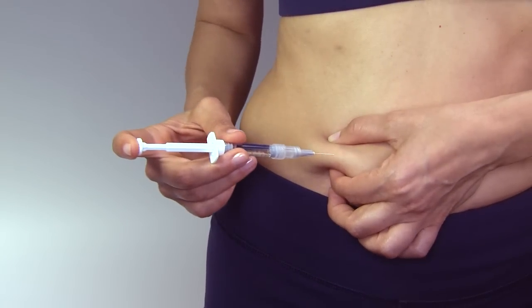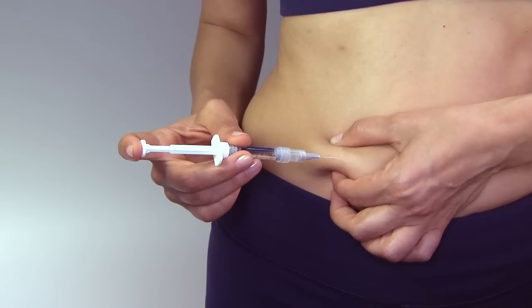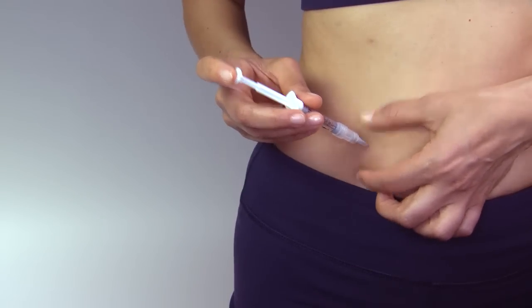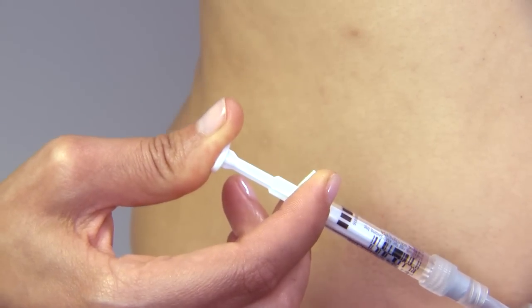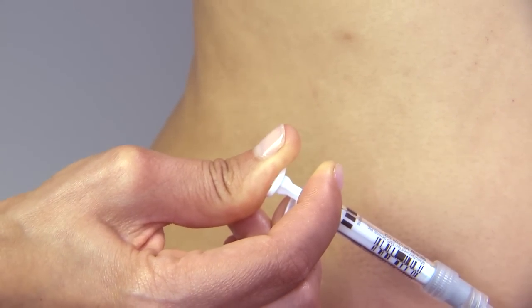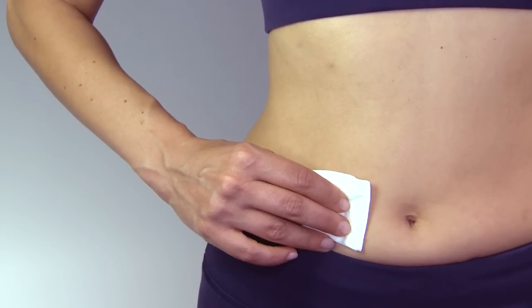Insert the entire length of the needle into the skin at an upward angle of about 45 to 90 degrees as indicated by your doctor or nurse. Release the hand pinching the skin and depress the plunger in a slow, steady motion until all the medication is injected. Gently withdraw the needle and apply pressure to the injection site by using a gauze pad.